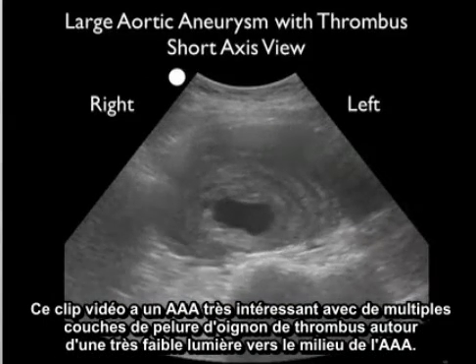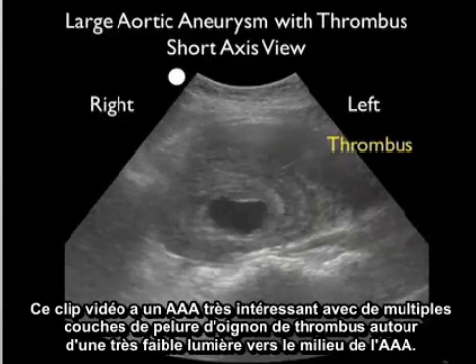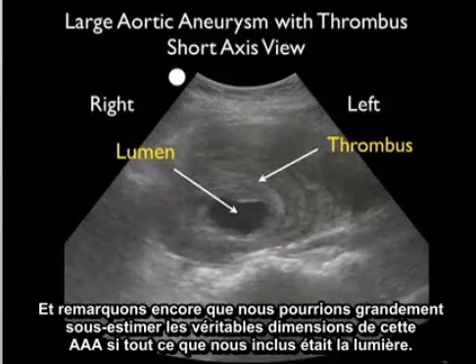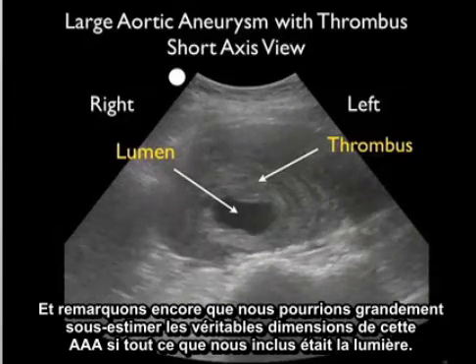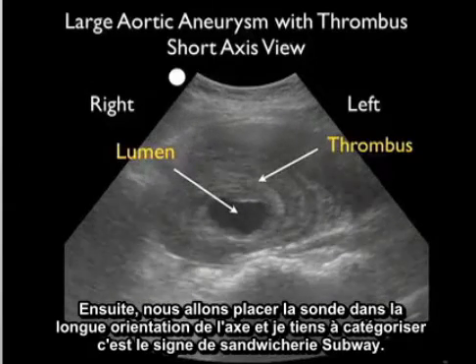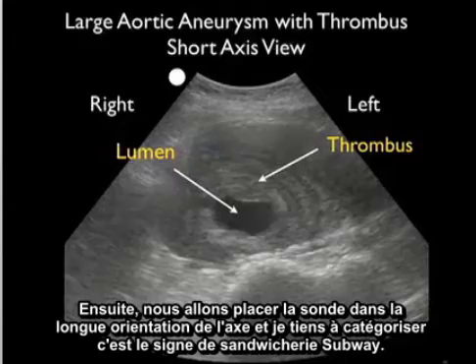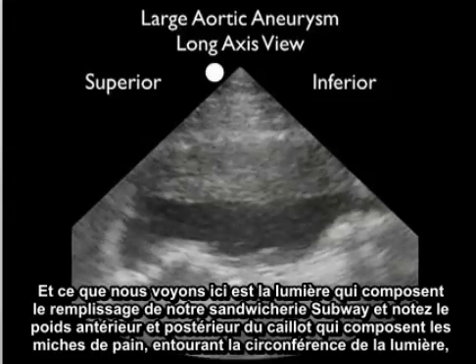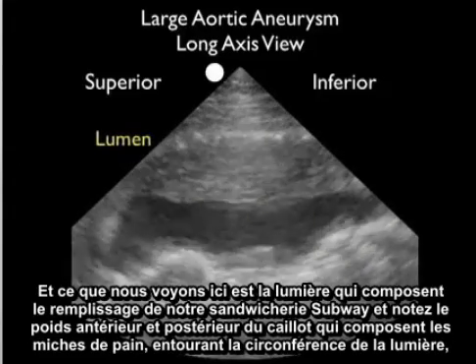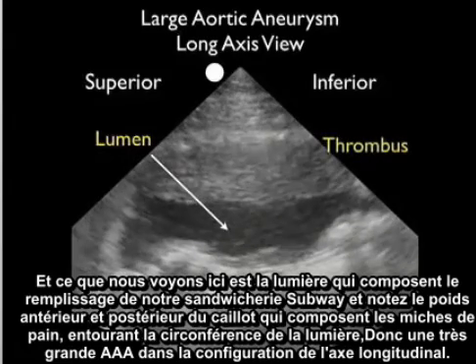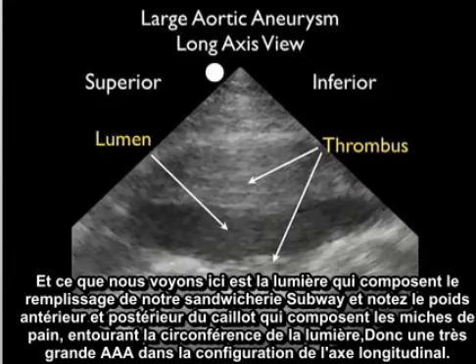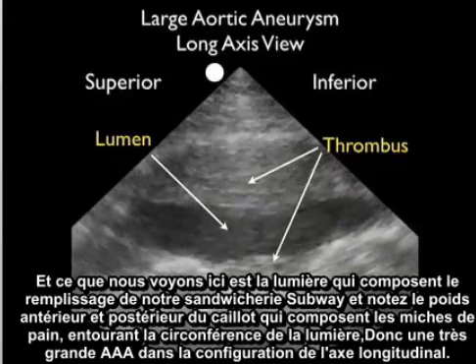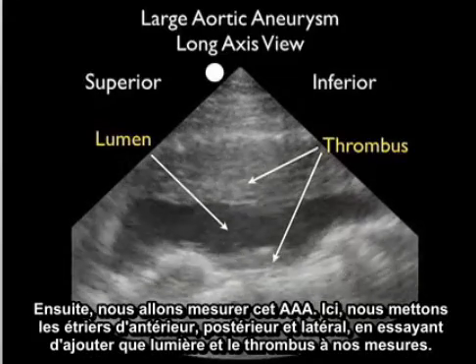This video clip shows a very interesting triple A with multiple onion skin layers of thrombus surrounding a very small lumen towards the middle. Notice that we could vastly underestimate the true dimensions if all we included was the lumen. We see here a very large burden of clot surrounding the lumen circumferentially in a short axis orientation. Next, we're going to position the probe in a long axis orientation — I like to categorize this as the subway sandwich sign — where the lumen makes up the filling, and the anterior and posterior burden of clot makes up the loaves of bread circumferentially surrounding the lumen.